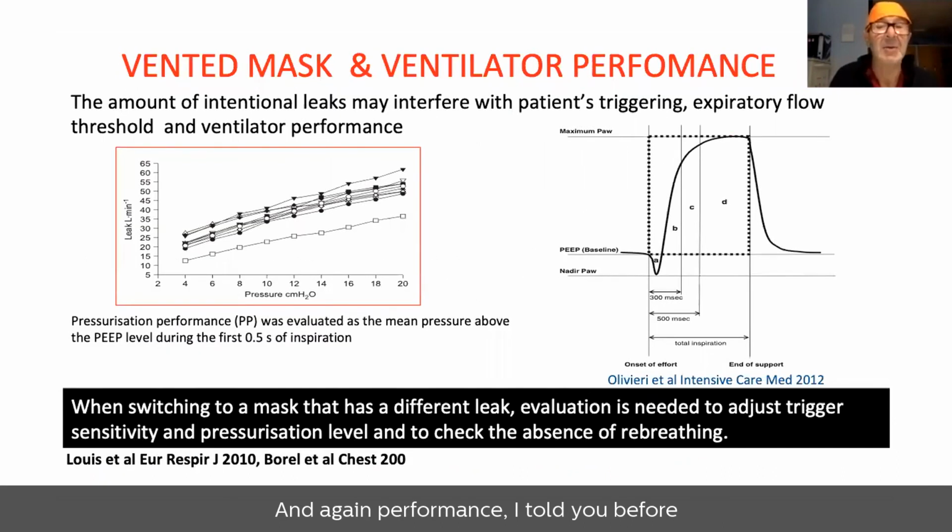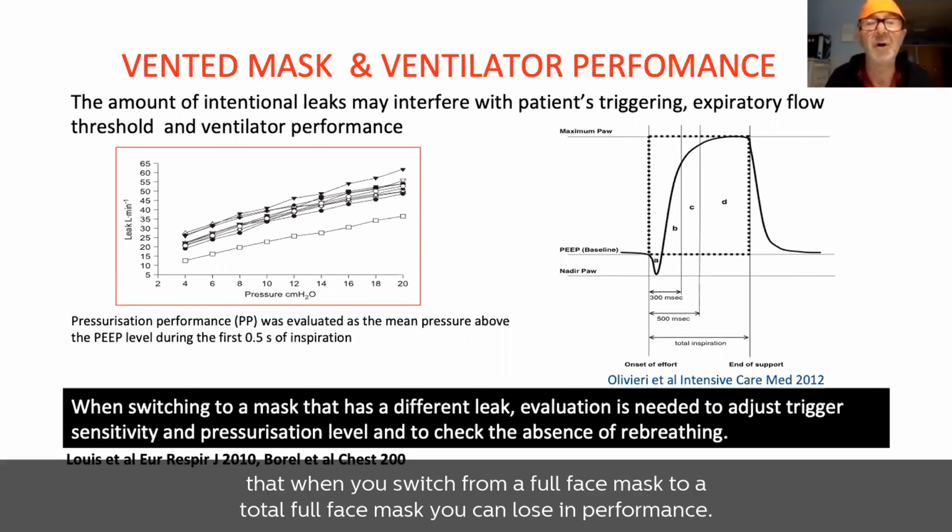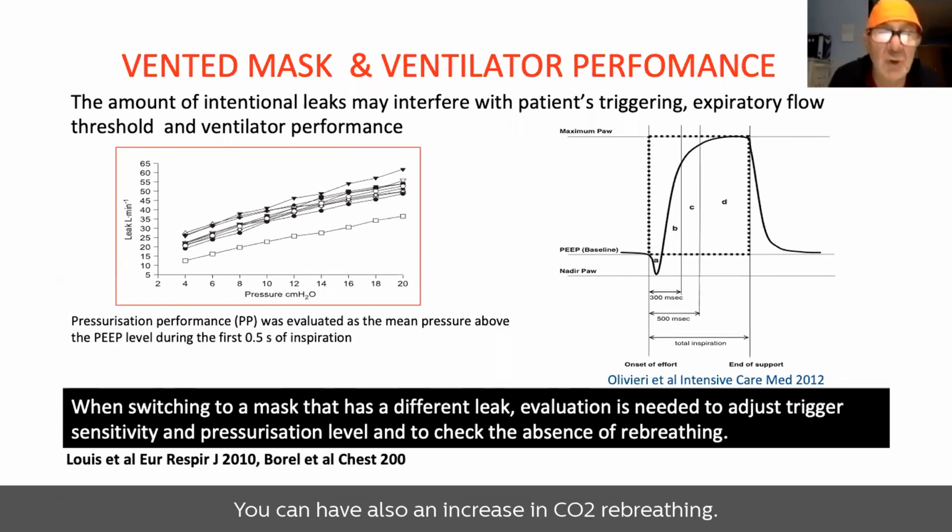And again, performance. I told you before that when you switch from a full face mask to a total full face mask, you can lose in performance and you can also have an increase in CO2 rebreathing.